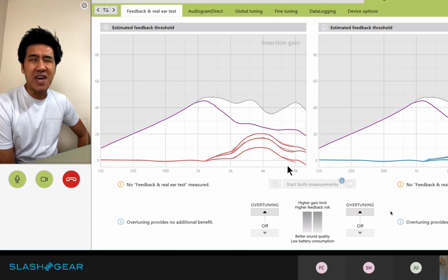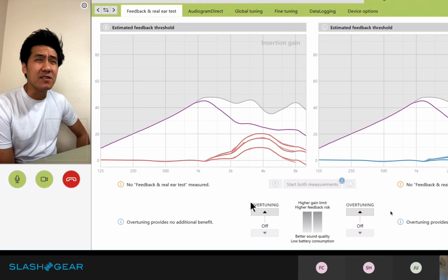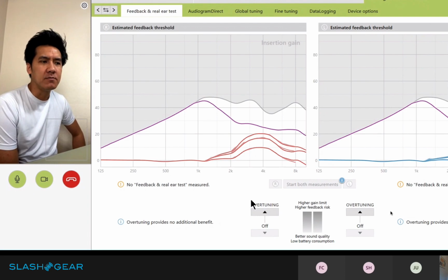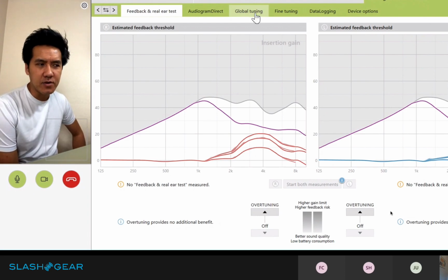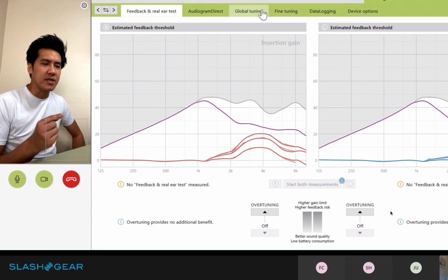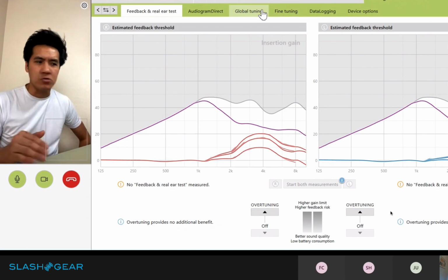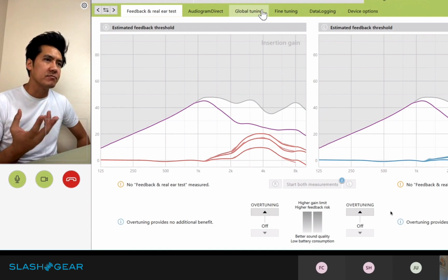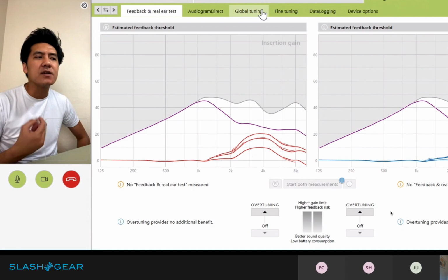Like I said, it happens maybe once, and sometimes I'm almost wondering if it's because I was streaming via the TV connector. It doesn't happen normally. It's usually after a certain scenario, I think. Okay.